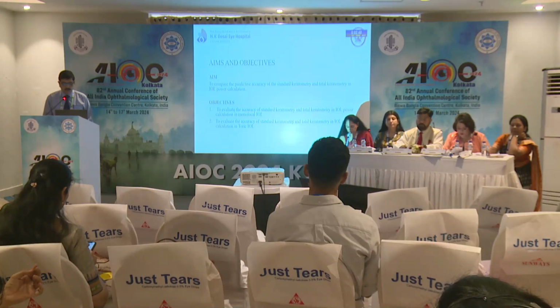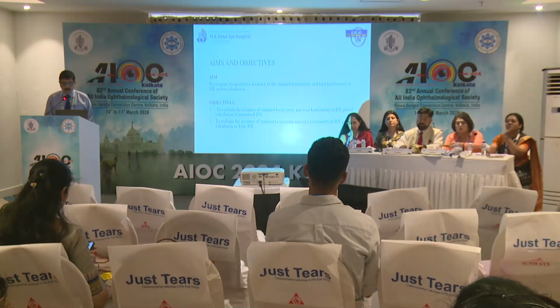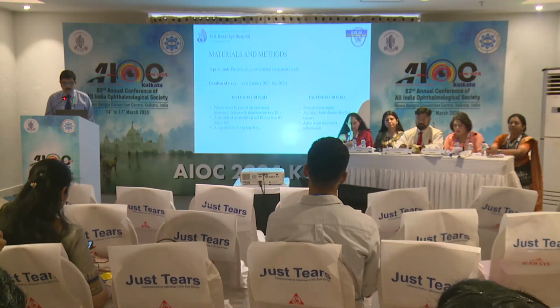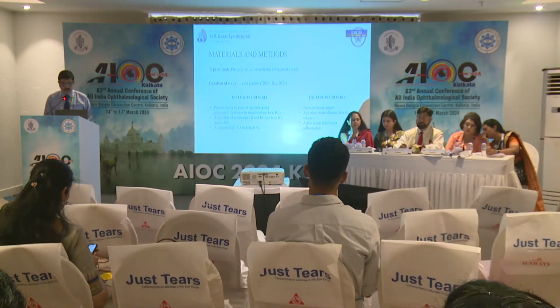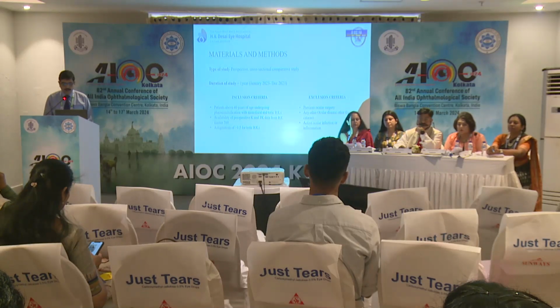In this study, we aim to compare the predictive accuracy of standard keratometry versus total keratometry in IOL power calculation, and we did the same for monofocal IOLs as well as toric IOLs. It was a prospective cross-sectional comparative study over 1 year. Patients over the age of 40 undergoing routine phacoemulsification with monofocal and toric IOLs were recruited. The availability of preoperative K and TK data from IOL Master was mandatory, and patients having more than 1.5 diopters of astigmatism were advised to go for toric IOLs.